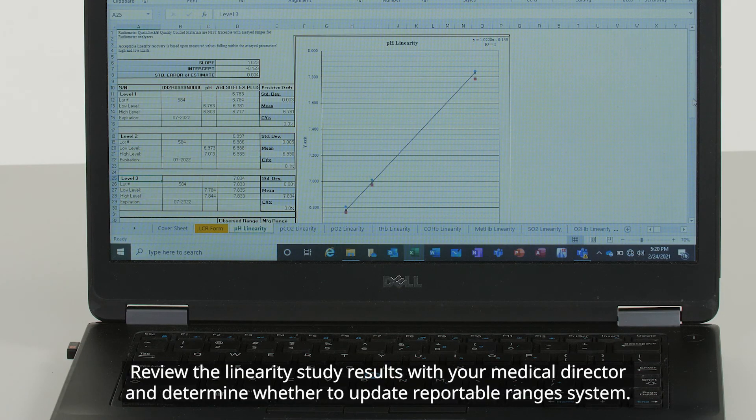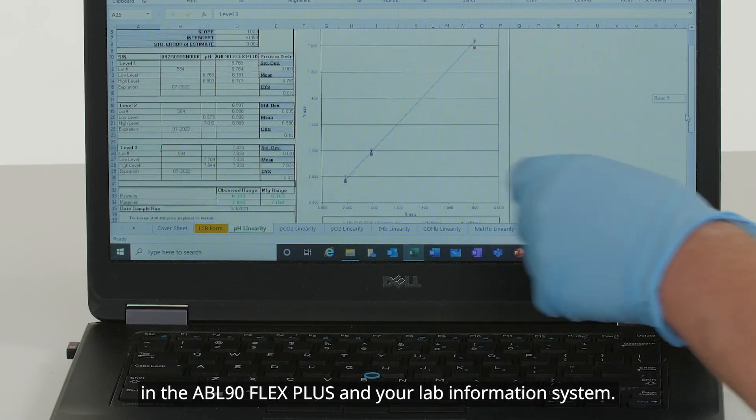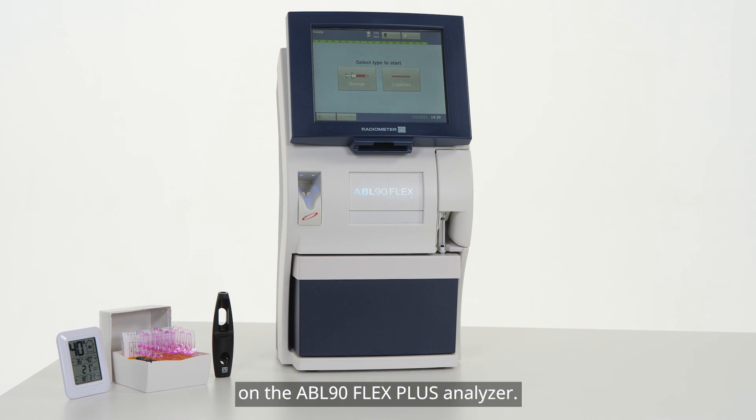Review the linearity study results with your medical director and determine whether to update reportable ranges in the ABL-90 Flex Plus and your lab information system. You have now learned how to perform linearity studies on the ABL-90 Flex Plus Analyzer.